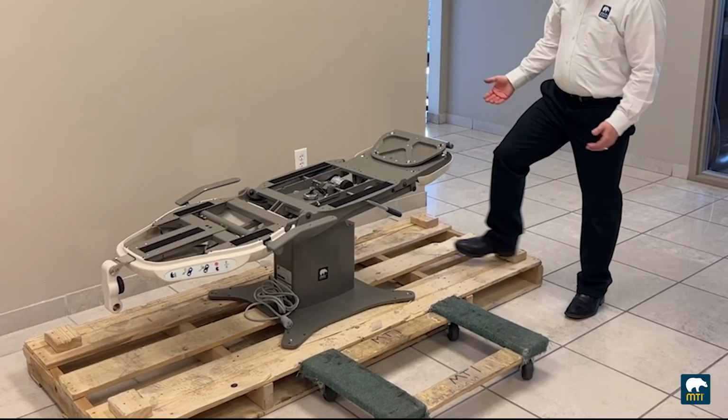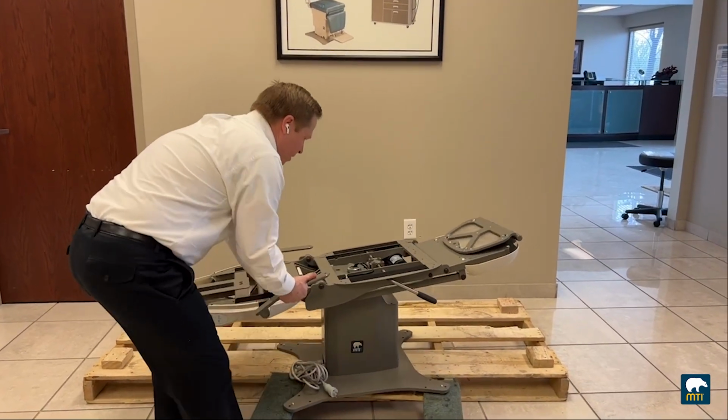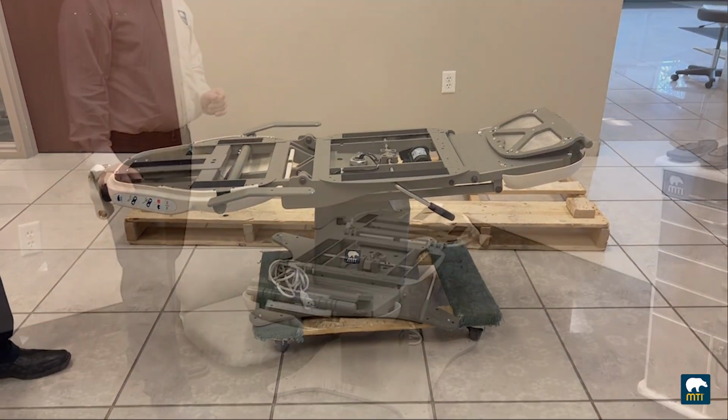Once the bolts are removed, slide one side of the chair onto the 4-wheel dolly and then slide the other side, making sure that it's even and centered. Make sure that you lift by the metal of the chair and not the plastic.